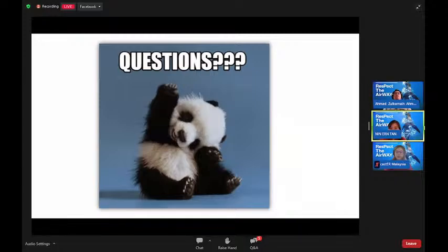The next question: in the rule of 15, PEEP 15 is so high and uncomfortable. Can the patient tolerate that, or do they need sedation? If the patient is very combative or agitated and not responding to the higher PEEP, then you might need to give some sedation to calm the patient down so that the patient is able to tolerate 15 centimeters of water of PEEP.